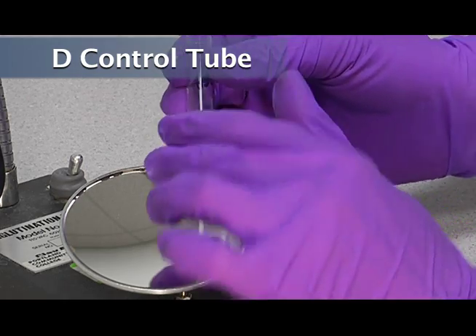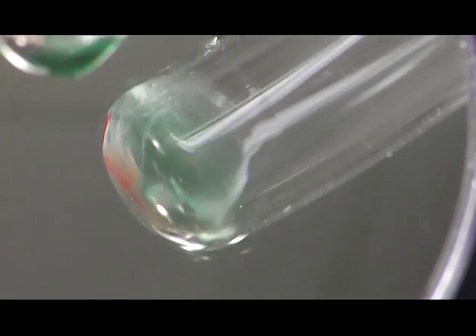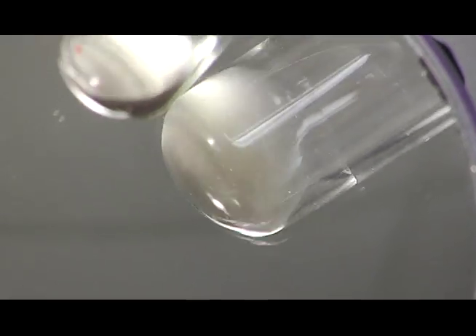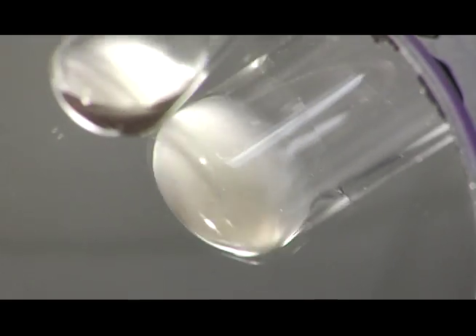And then read the D control tube in the AHG phase. And see the cells streaming off nice and smoothly. A nice negative reaction as well.